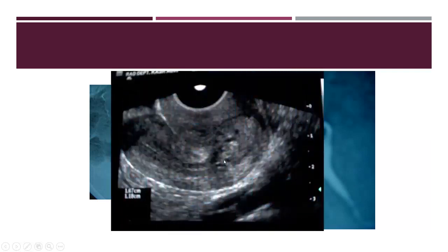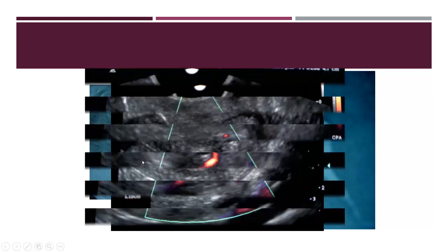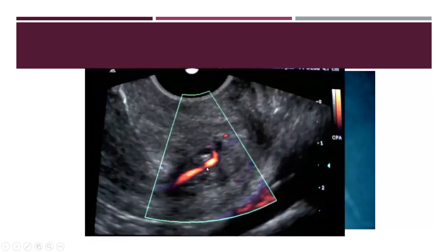Here, we put a very narrow dilator which can opacify the cavity, and on doing ultrasound, there was a large cervical polyp. This was causing obstruction to the passage of contrast, with the typical vascular pedicle sign. So this is a cervical polyp causing capacious cervix and malposition of the uterus.